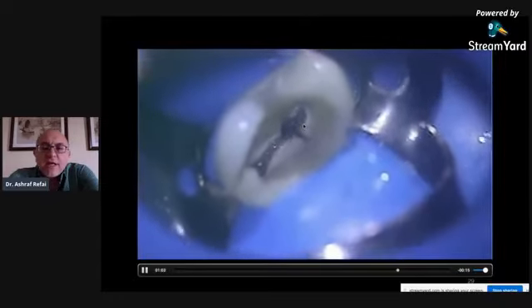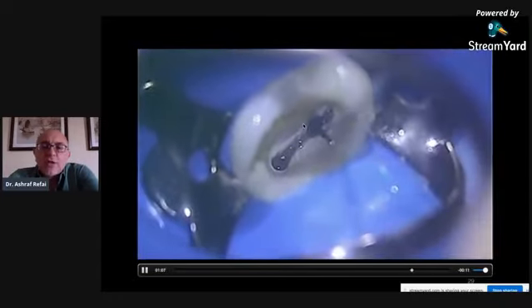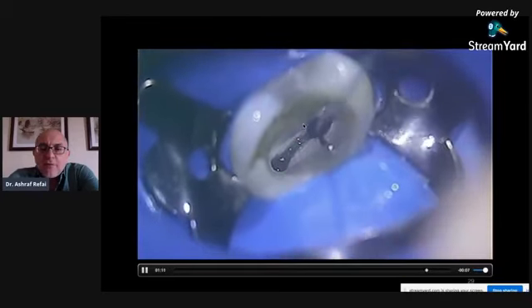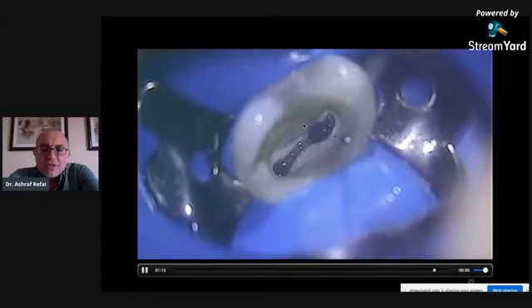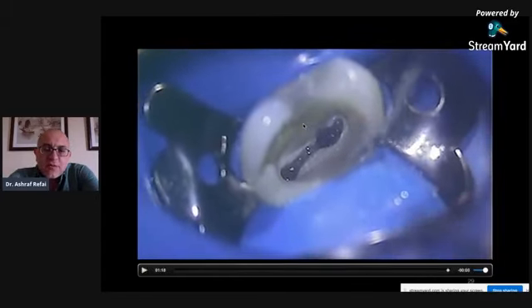Now, I would say 95% of the time, if I did that, I would probably push the instrument back into the canal. So it would seem very logical for you never to do this. This is a situation you should never try at home. It is very risky to try and remove that, because I've had experiences where I've actually pushed the instrument back into the apical area, and it made my life much harder when I had to either bypass or remove. So in the case of a bypass, be happy that you bypassed. Don't try to do anything else.